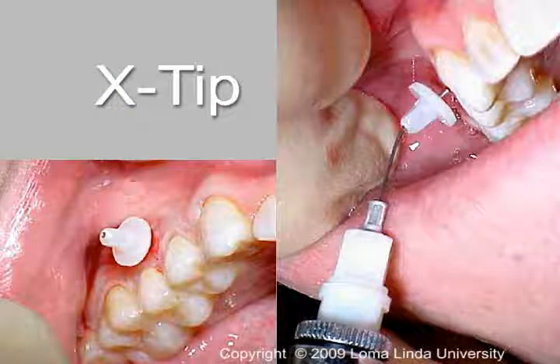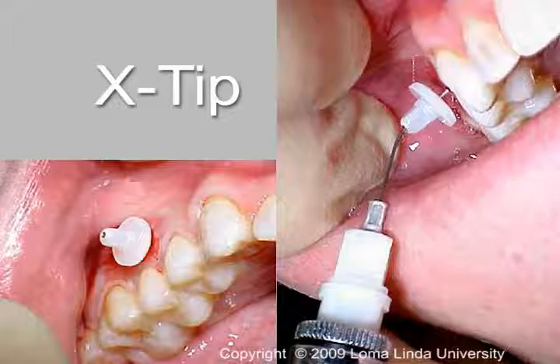The X-tip is a combined perforator and a sleeve through which the needle is placed. This is generally effective and simplifies needle positioning. One problem is that there is a greater likelihood for the anesthetic leakage around the opening and into the oral cavity.